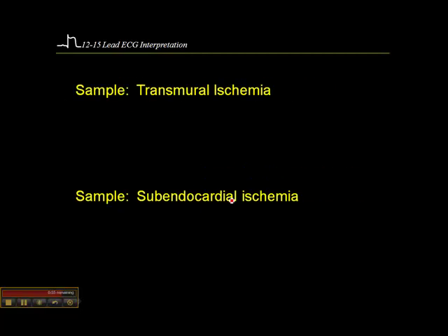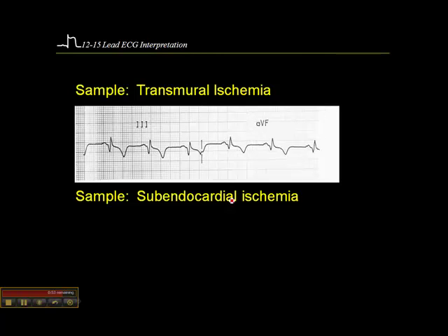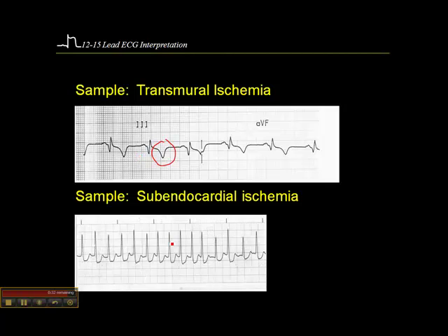When you see ST elevation above the baseline, that's indicative of injury. When we see symmetrically inverted T waves, that's ischemia. For example, inverted T waves in leads III and aVF indicate some inferior wall ischemia.